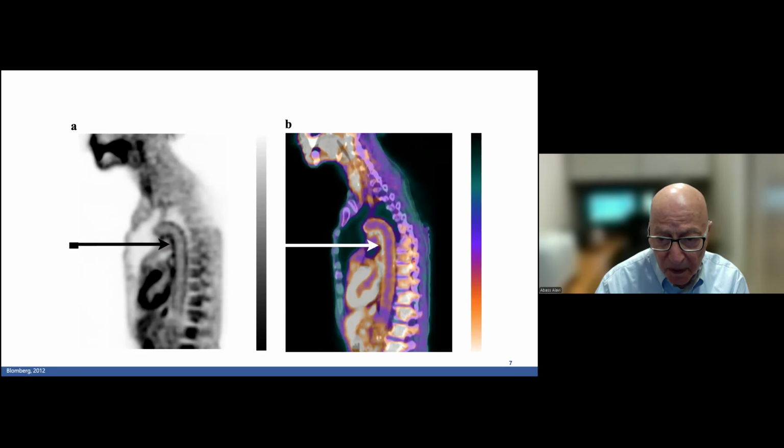And of course PET-CT has become a major development in the discipline of PET, so we can put PET and CT together or side by side and see the relation between the molecular aspect of the disease as well as the structural aspect of the disease.